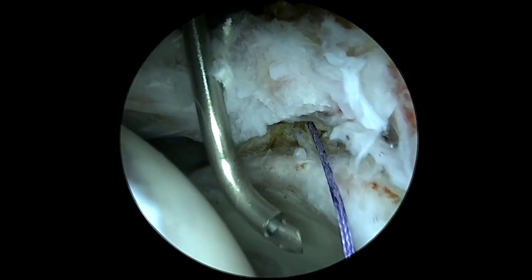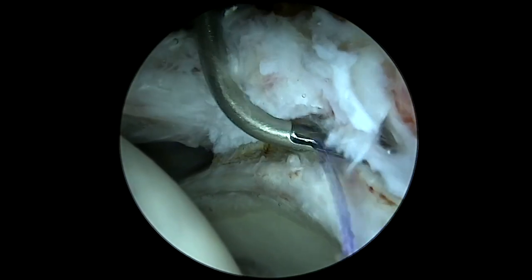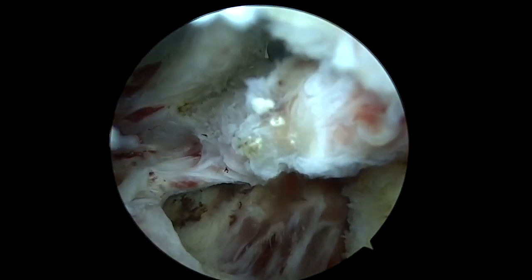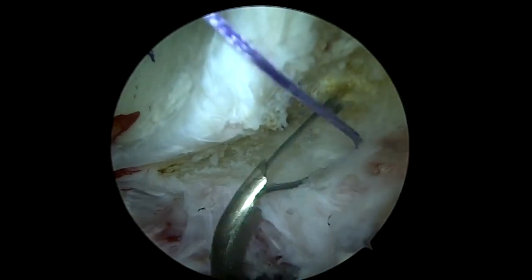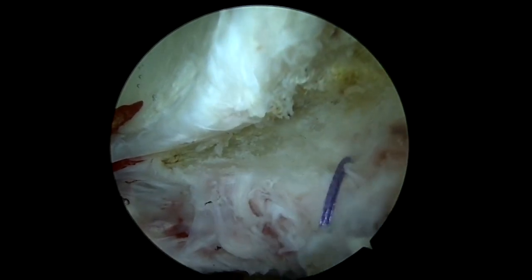Working percutaneously from the mid-anterior portal, a number 1 Vicryl suture is passed through the proximal capsular cuff using a 70-degree suture passer, and then subsequently retrieved and tensioned outside the body with a hemostat. This is then repeated posterolaterally, working percutaneously from the anterolateral portal to pass, retrieve, and suspend a second suture. Suspension in this manner provides excellent visualization of the acetabular rim for both subsequent central compartment work and placement of the anchor for medial capsular defect reduction and repair.